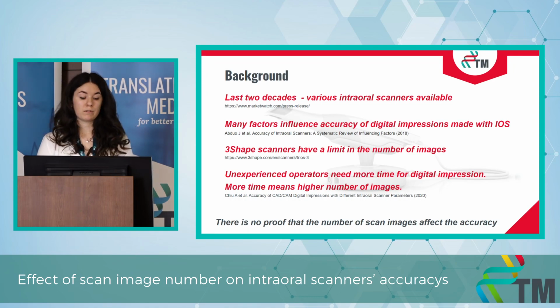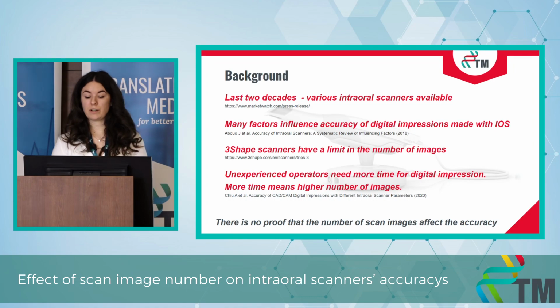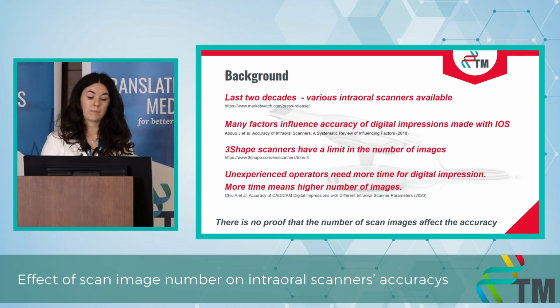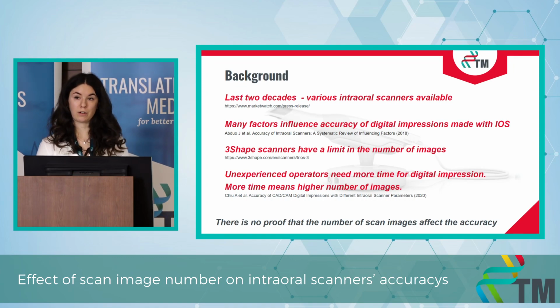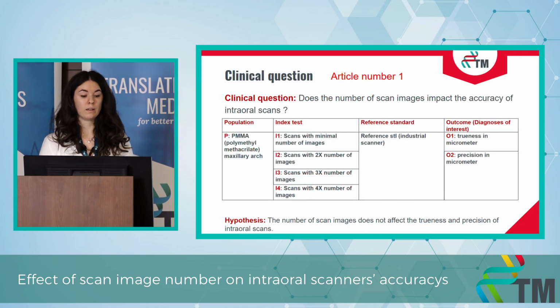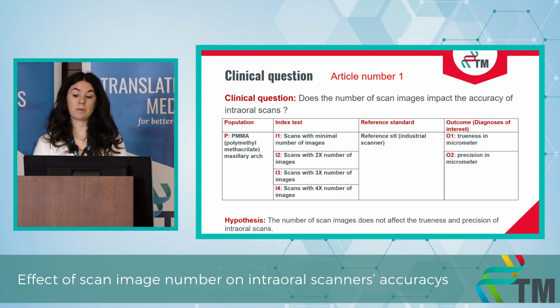And what we have found is that inexperienced operators need more time to make these digital impressions, and with more time, we will have a higher number of images, and we don't have proof whether the number of images affects accuracy or not. That's why we have a clinical question here, which is, does the number of the scan images impact the accuracy of intraoral scanners?